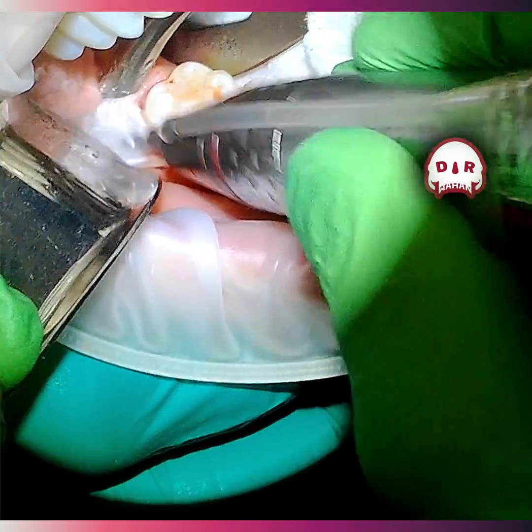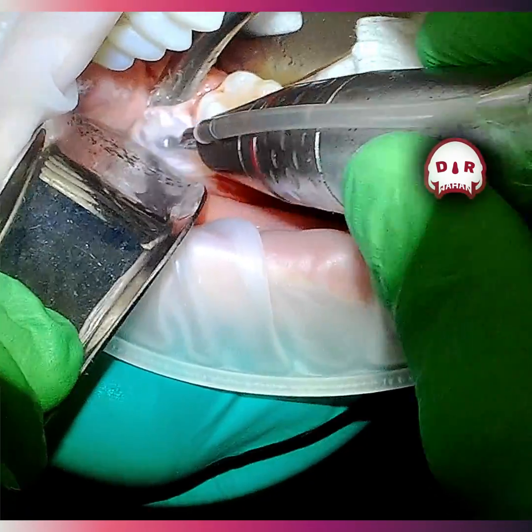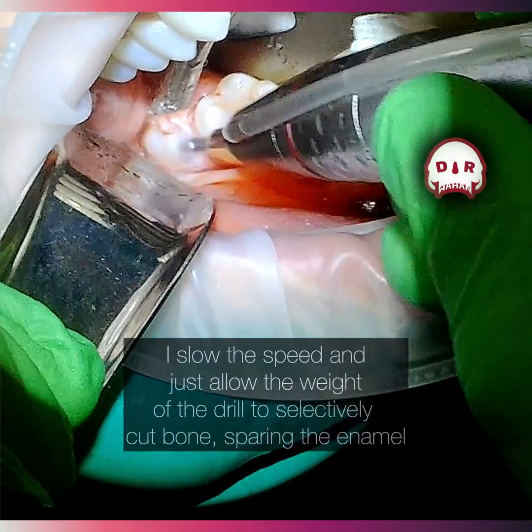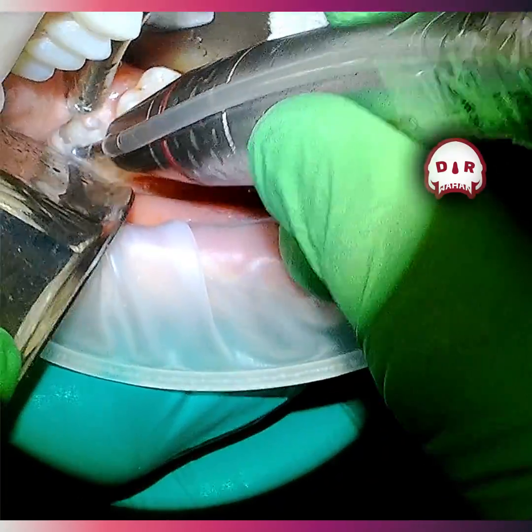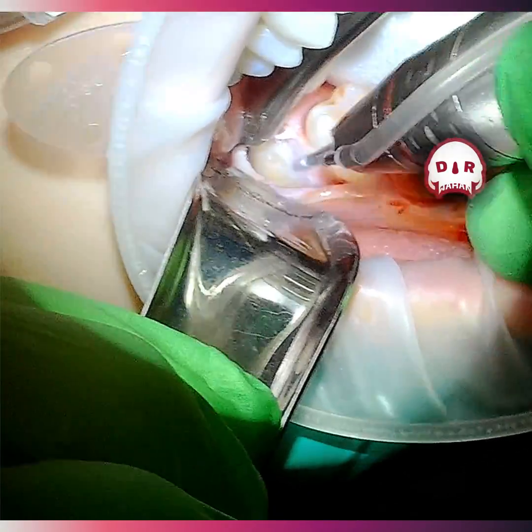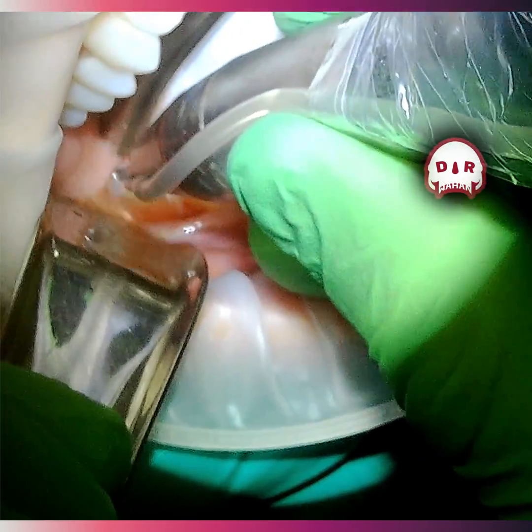What I'm doing here is setting the burr on the bone, running it not even at full speed, and just allowing it to selectively cut the bone. Because the bone is less dense than the enamel or the tooth, once it gets through that bone and hits the tooth, I can actually feel the density change just by holding the drill — I can feel it and also hear it because it sounds different. Once it gets to that point, I can just slide it down a little bit and let it define the buccal, or the front part of the tooth, and make my buccal trough.